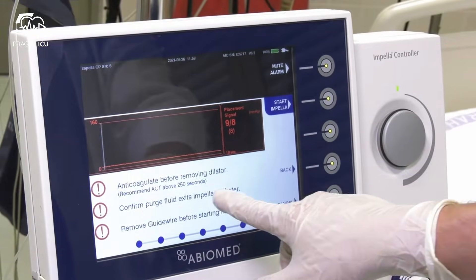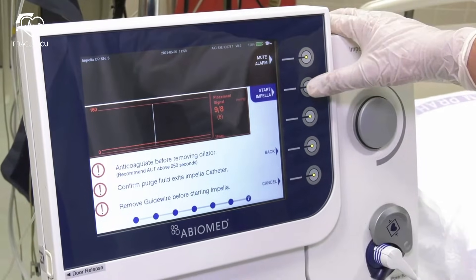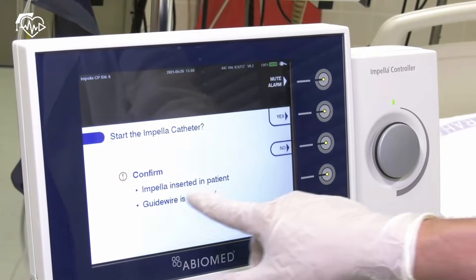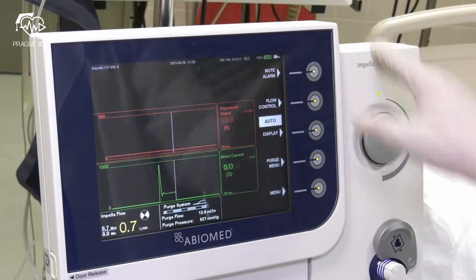The Impella catheter is inserted into the left ventricle and position is checked. We can start. Push yes and the Impella will start in auto mode, during which RPM increases to maximum within one minute.